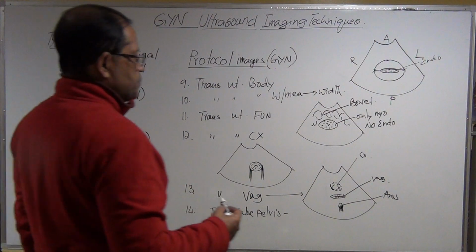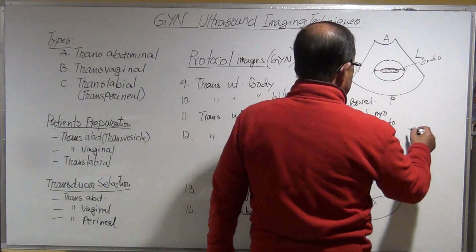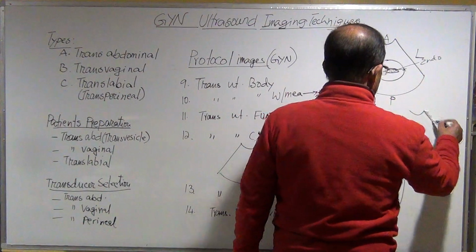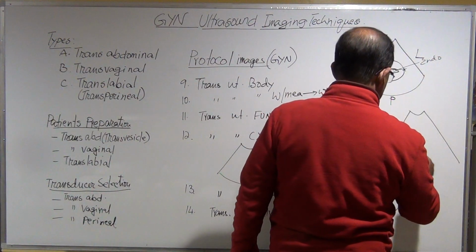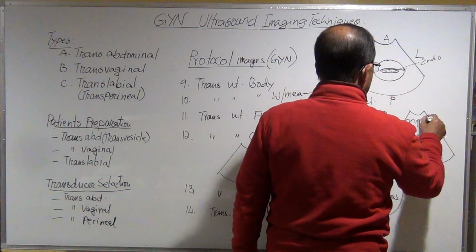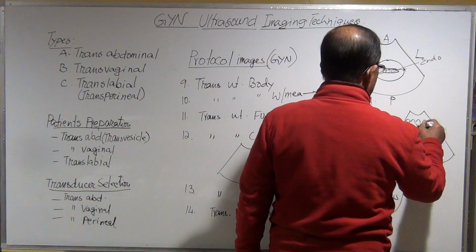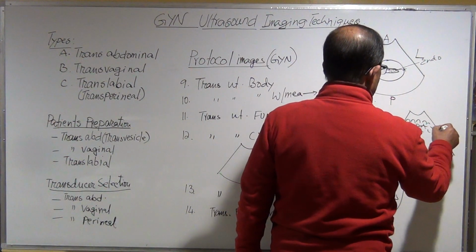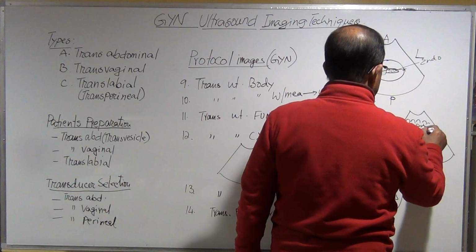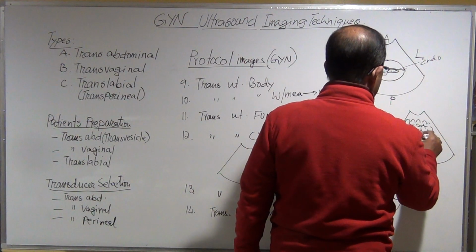So in the false pelvis you might see, most of the time, bowel. There is too much bowel over there. Bowel is moving, and you might see a solid mass.